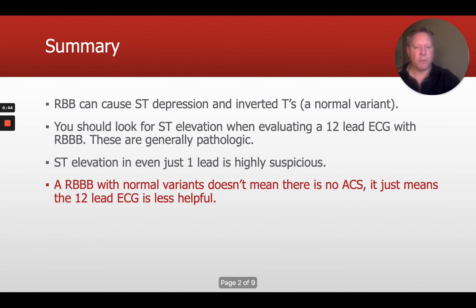acute coronary syndrome. But there's a couple of helps on how to figure out bundle branch blocks, what a right bundle and a left bundle should look like, and what a right bundle and a left bundle shouldn't look like, so that when we do some cases here in a couple minutes, you'll have that ammunition if you didn't have it before, and that should help you do the test your knowledge area a little bit easier. All right, thank you.